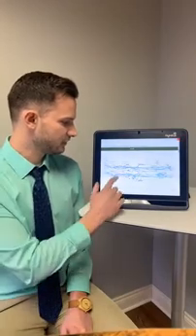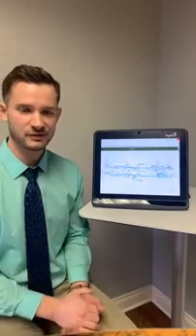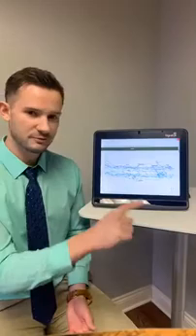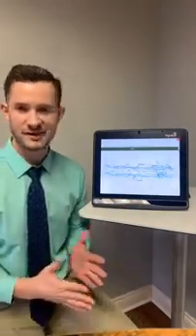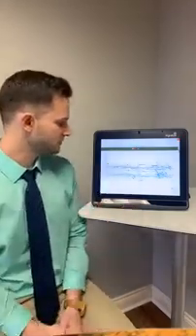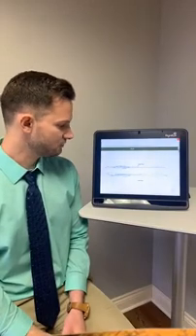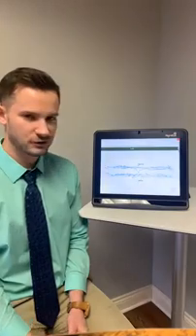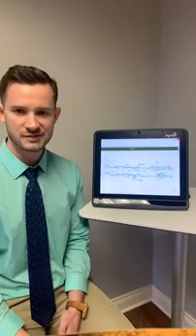And really as we continue to progress through, you can see that it's not a perfectly smooth straight across line. And you see there's different flight paths where the patient's going over and over although the dot on the screen is not necessarily doing that. It's just going smoothly straight across over and over. Here it is again, we can see there are some jerky movements, losing the target, kind of jumping back and forth, kind of like that child who skips words or repeats lines.